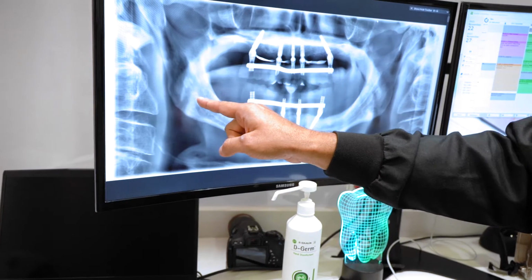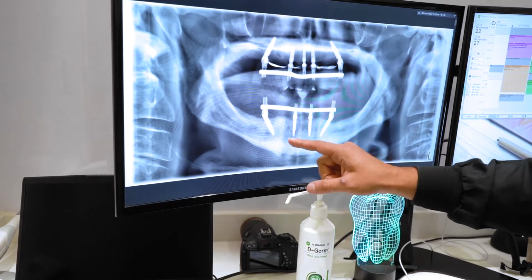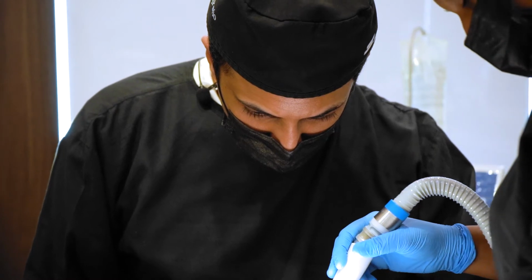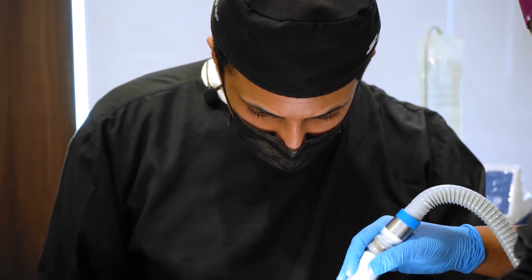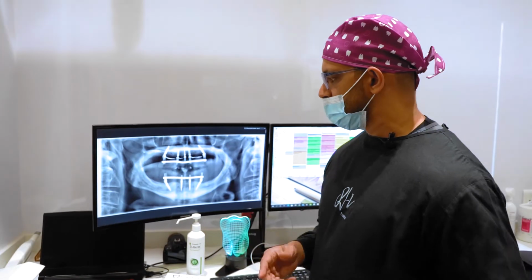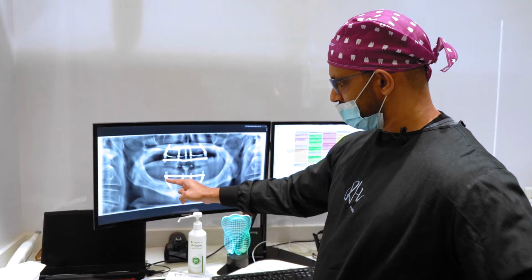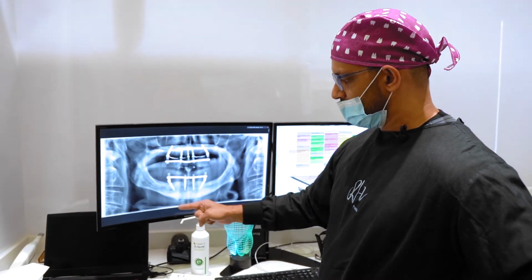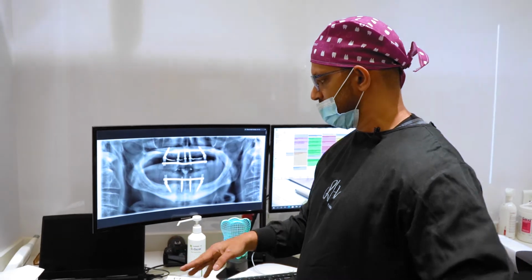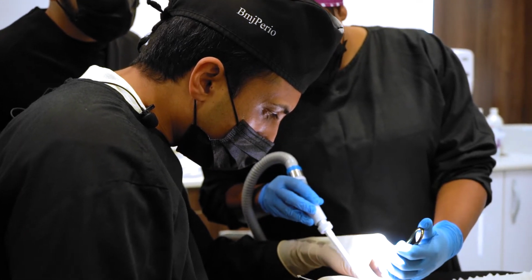So that nerve runs down the mandible but stops around where the premolars used to be. And there's no nerve in front. So the implants can be placed at angles. Where we become cooler than the surgeons is that we can now add attachments, or almost in simple terms elbow joints, onto the implant that straightens up the emergence. Because obviously currently if the implant is placed at an angle, my prosthesis needs to sit flat down on a flat implant interface. And we place these joints to correct that angle.